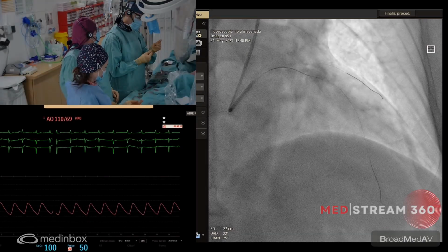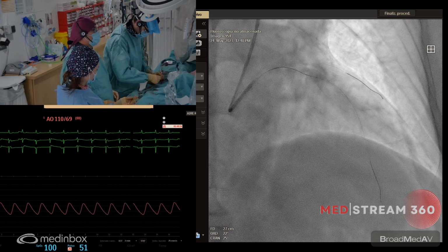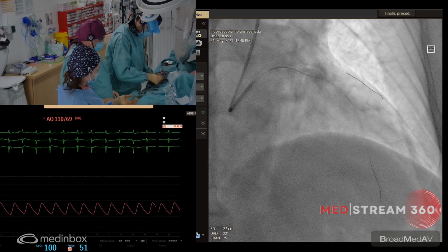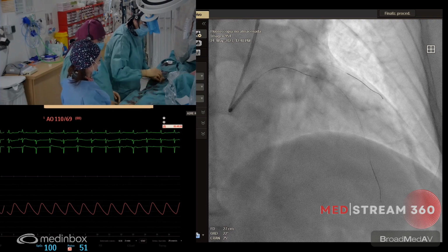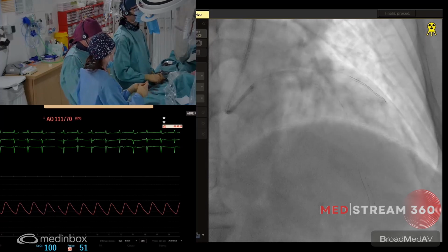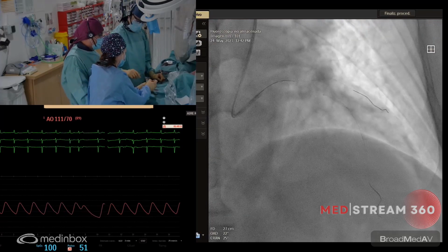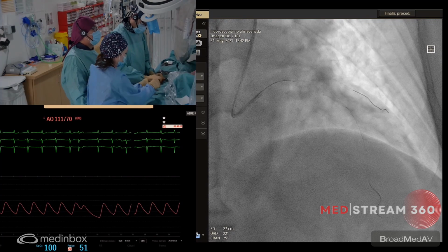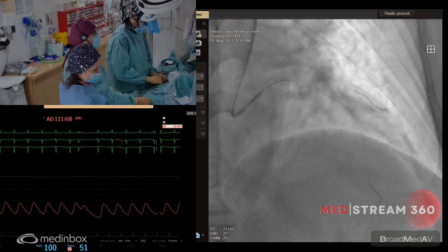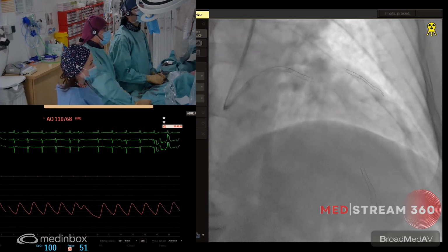So this is a dual lumen microcatheter. You can advance it as a rapid exchange through the wire we have in the LAD, and then try to advance a second wire through the distal port. I'm going to change the shape of the distal tip of the wire, because it was done before the dual lumen microcatheter, and this, I think, is the last chance to cross to this diagonal that remains. Keep in mind that the third diagonal is not a very big one. Test, please.